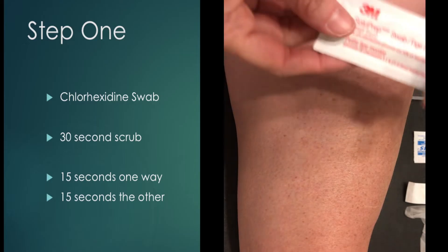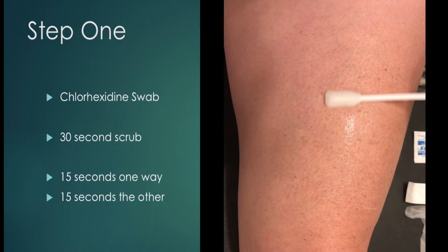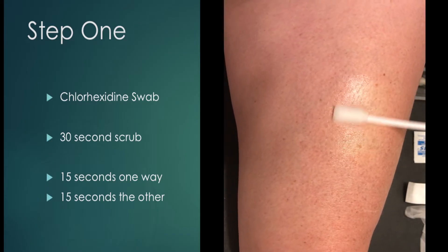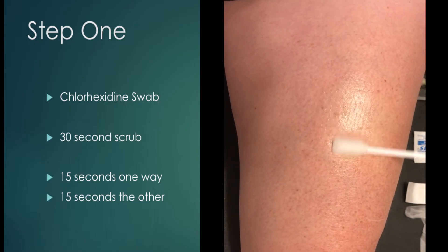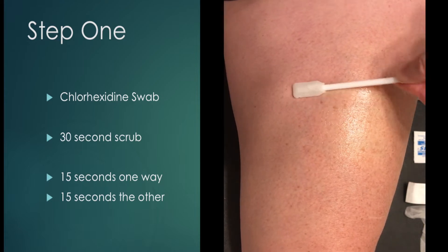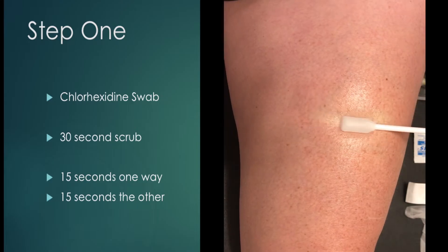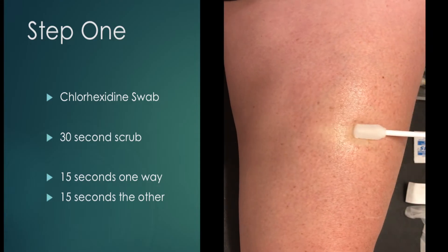Step one: clean the site. We're going to use our chlorhexidine pad and scrub for 30 seconds. We initially begin with firm pressure using strokes going up and down, covering a nice base to reduce microorganisms as we're going to be entering the skin. After a 15-second scrub going up and down, we flip the chlorhexidine pad and use a back-and-forth motion for another 15 seconds to ensure the site is prepared efficiently for insertion. Once completed, we let it air dry — it's important to note that we do not fan the site.